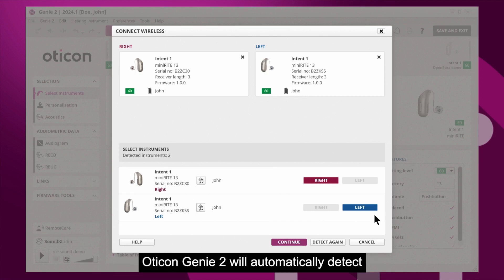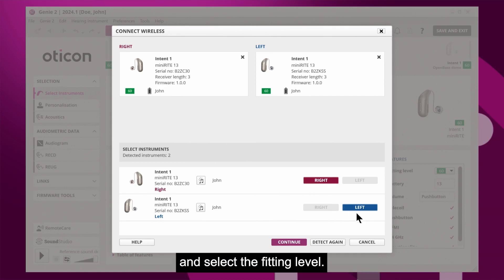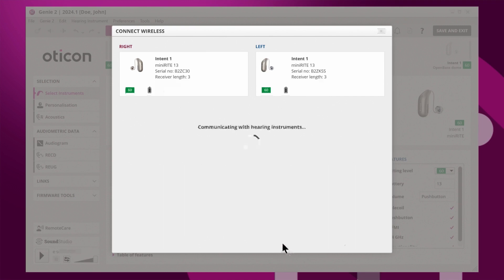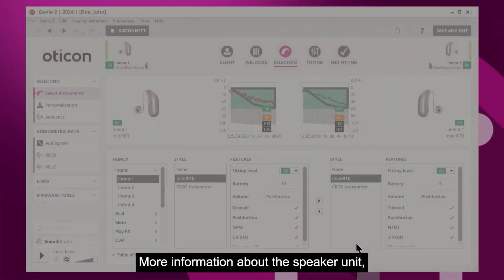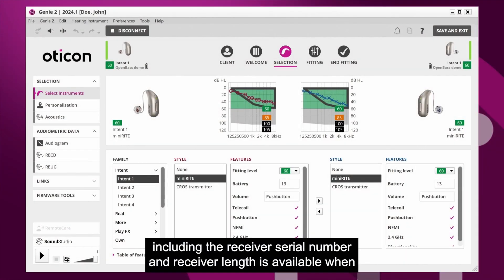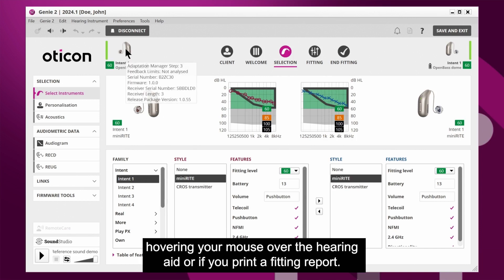Oticon Genie 2 will automatically detect the receiver length, assign the hearing aid to the right or left ear, and select the fitting level. More information about the speaker unit, including the receiver serial number and receiver length, is available when hovering your mouse over the hearing aid or if you print a fitting report.